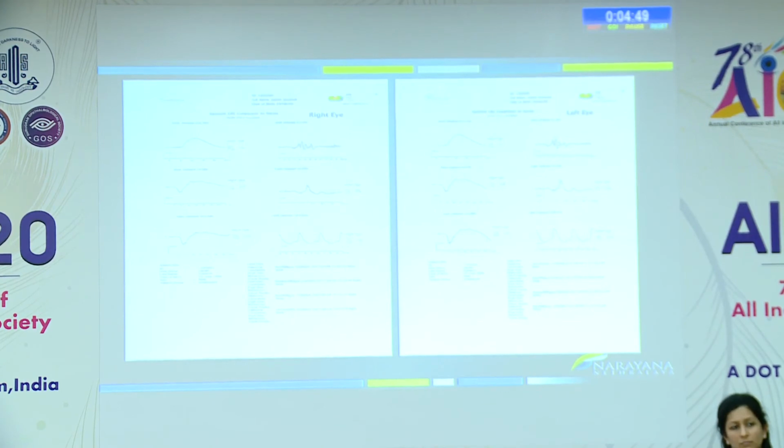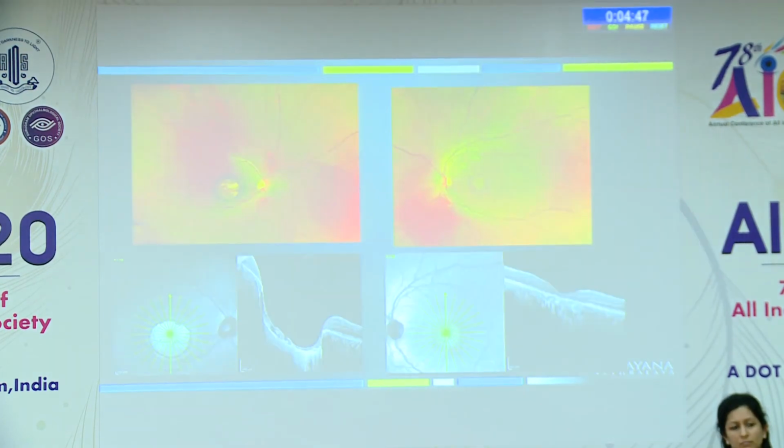So basically what it's indicating is this lesion is localized to the fovea, and the rest of the retina is functionally intact. That's compensating for the lost foveal structures. So this was a case of toxoplasma scar. Given the vision is 6/20, not that bad for a lesion, it most likely indicates an intrauterine lesion. Maybe from birth the patient has extrafoveal fixation.